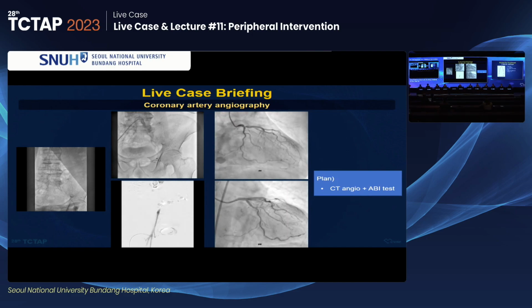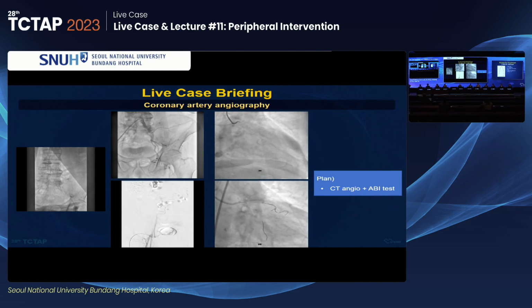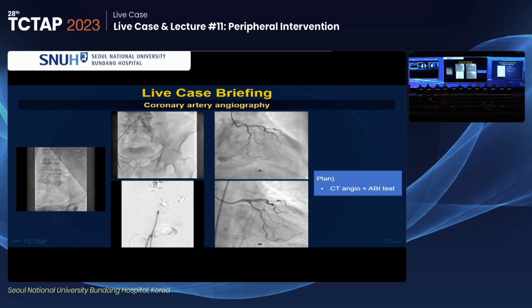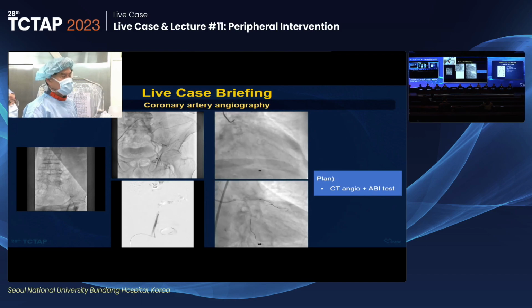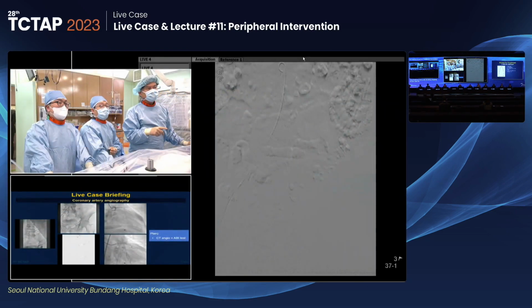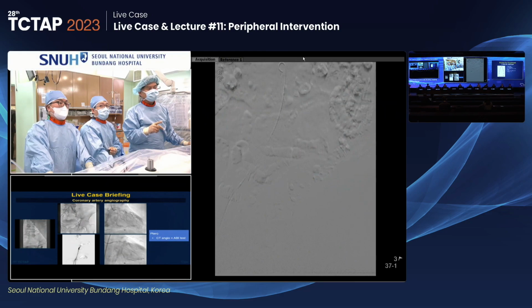While I was coming here from the Walkway Hotel, they already took the right side puncture and the baseline pigtail angiography. And this is today's baseline angiography in the AP view by DSA image using a pigtail 5 French catheter. Please show the baseline image.